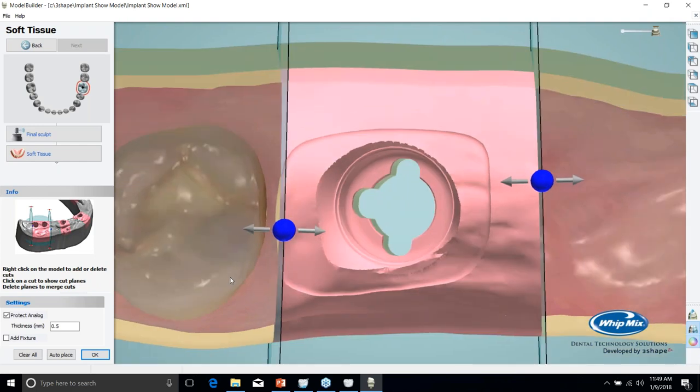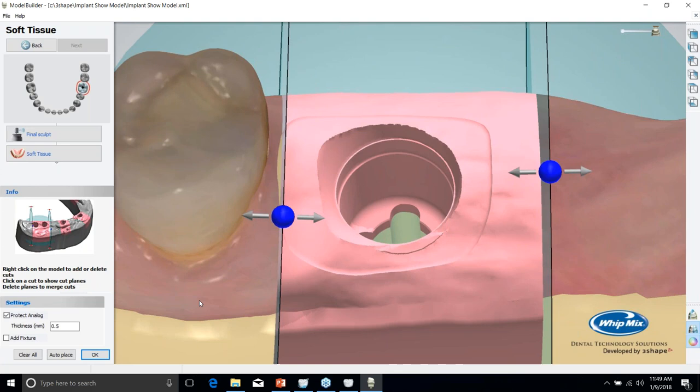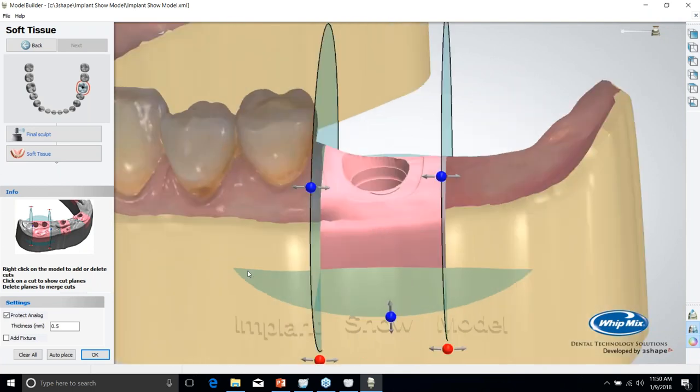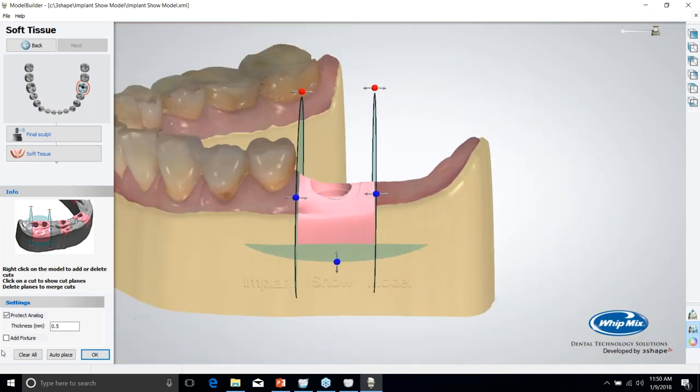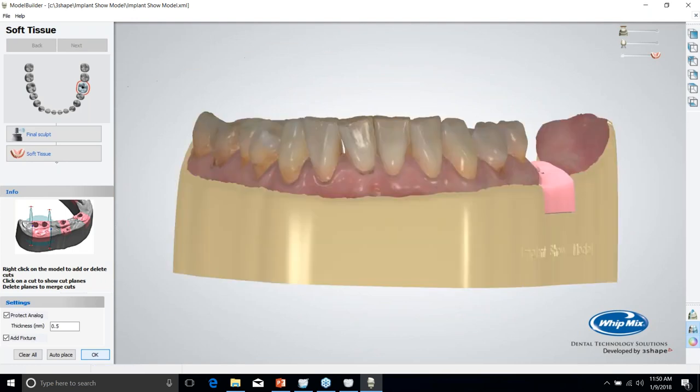So you may get rocking with your analog. But if I turn on protect analog, then it's actually going to build a wall through here that will allow that analog to still be fully encompassed by the rigid model resin, and then the tissue will go over it. And then the add fixture, what that does, I'll have to show you in the next stage, is if I don't have that on, the bottom of this tissue is just completely flat. But if I turn the fixture on, it'll add a little nub that helps you index and make sure that you've got the tissue back in the right spot.